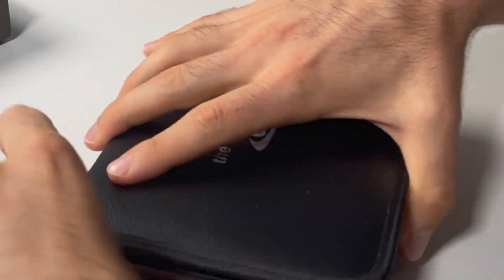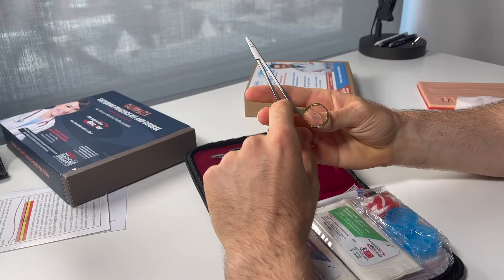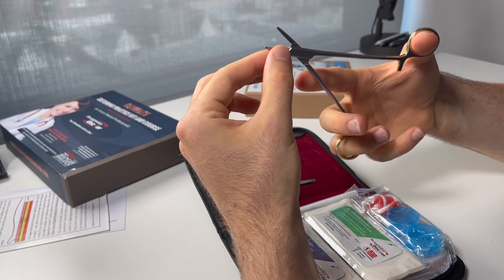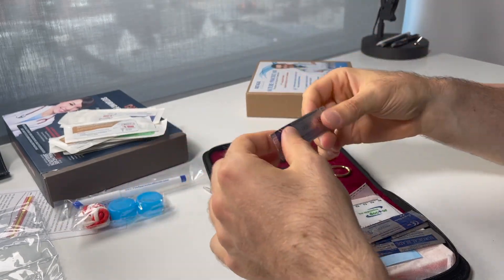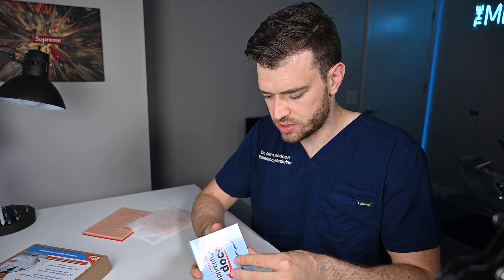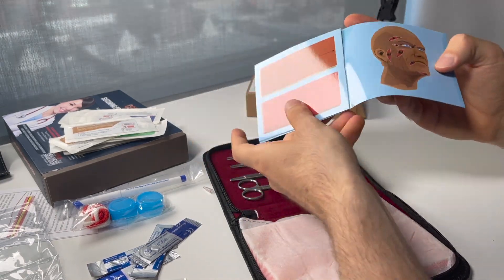I've been waiting to rip the plastic off this for a long time. Wow, I'm pretty impressed — this is nice. The needle drivers aren't real gold-plated, but in the OR needle drivers are gold-plated, and these are actually really nice. We've got 3-0 nylon, 3-0 silk, and chromic gut. If you watched the history portion, you know about that. These are real blades. We also have a ruler so we can measure our wounds, and a little template that teaches the basics of how to do a suture and shows you how to pass the suture through. Very cool.